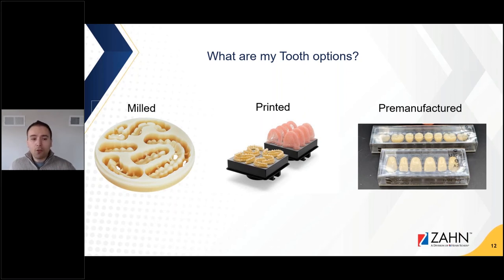And also very inexpensive to make. You don't have to mill anything. You just send it to the printer, it prints real quick, and it prints at a very high resolution, so you're not really limited by the size of the milling burr.